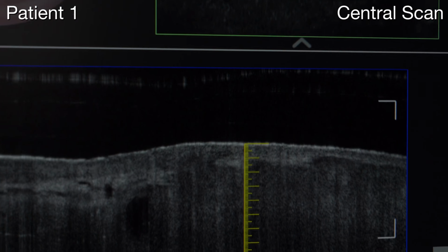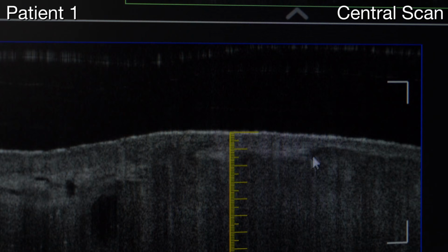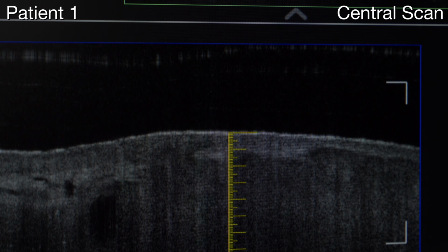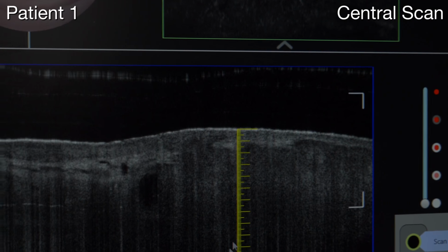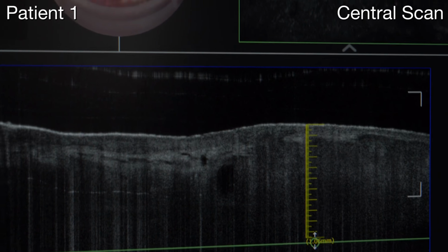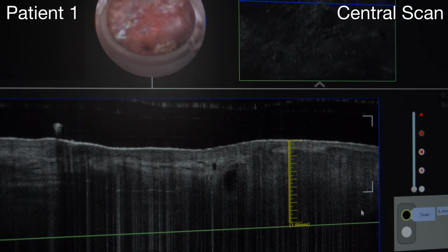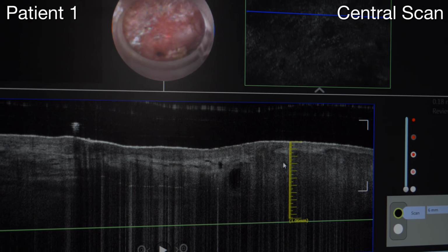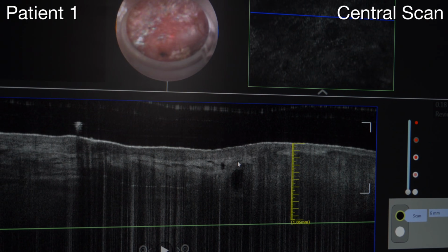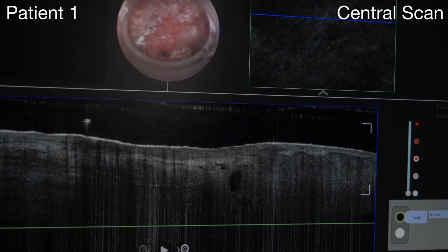If we scroll around, we can see the dark rim again and the tumor cyst. I did some measurements of the tumor thickness. I think it's slightly bigger than 1 millimeter, because here there is no real demarcation of the tumor, but I think it's clinically and also macroscopically bigger.